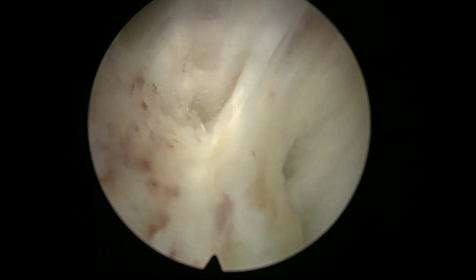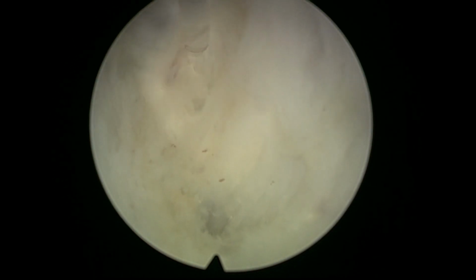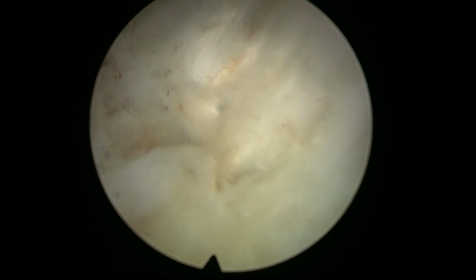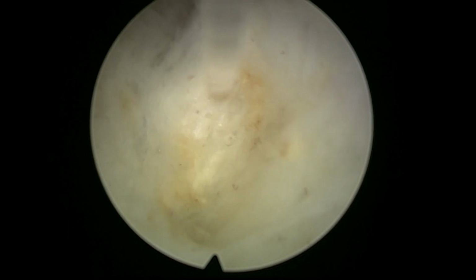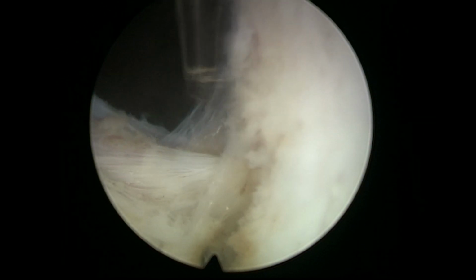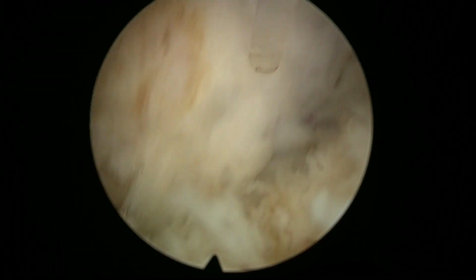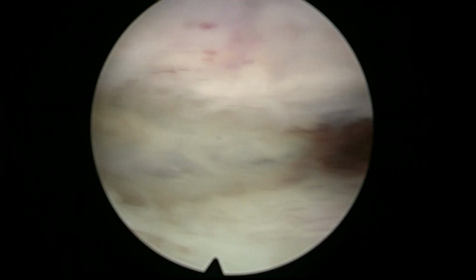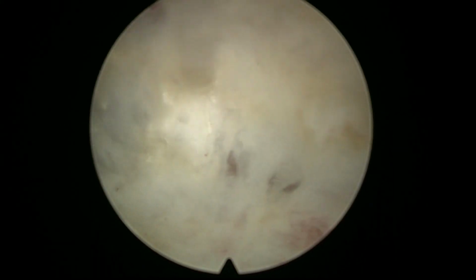You see, with this virtual basket fiber and pulse modulation, the hemostasis we are getting is fantastic, which is also nice because you can spend the time of the operation worrying about the dissection on the plane and not so much having to concentrate on keeping a good hemostasis. So there we are. This is below the prostate now.